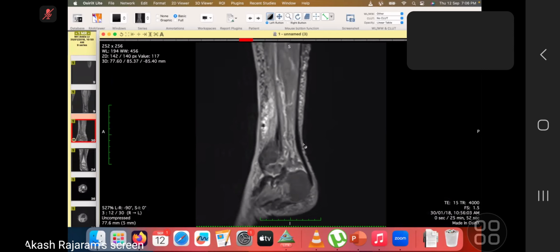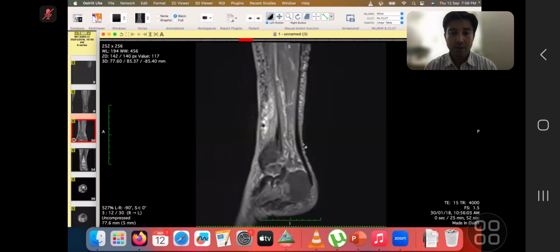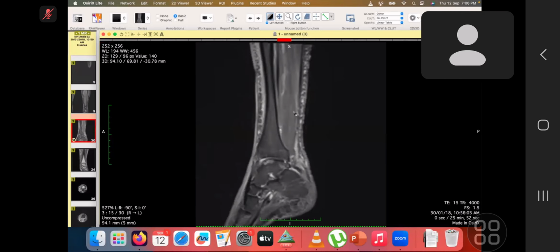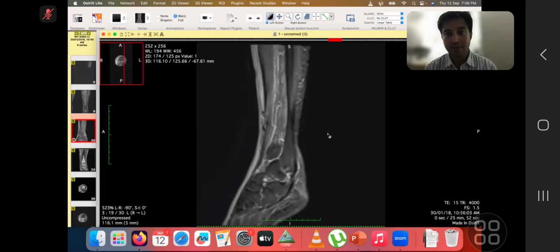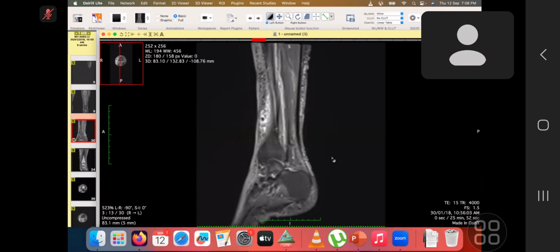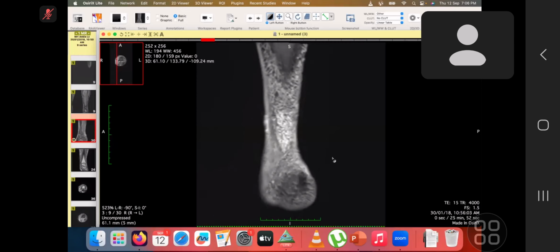Are you able to scroll? I can't. Can you just request again? Or maybe if you want, I'll scroll, but can you request control? It says you have already given. Okay, yes, you're able to scroll. Okay, I'll look through the MRI images provided.